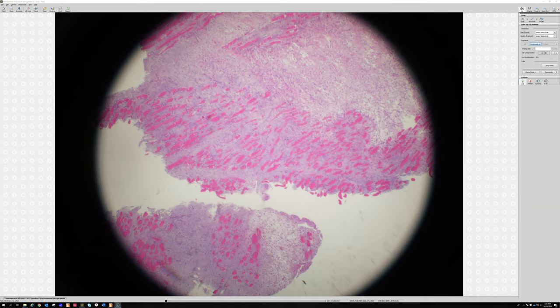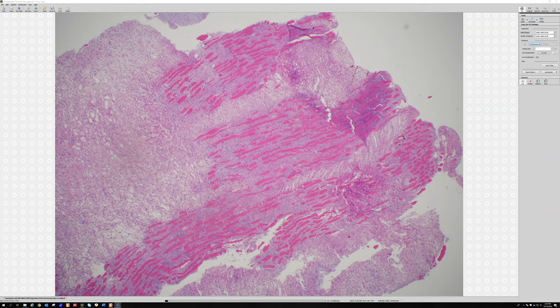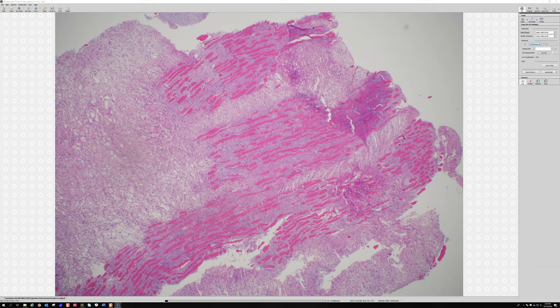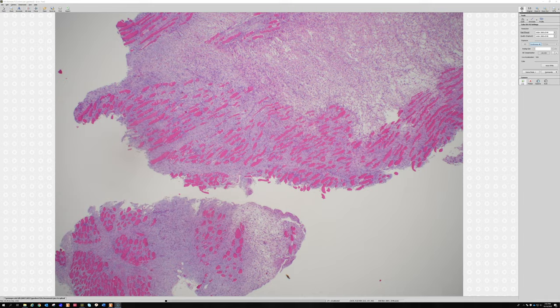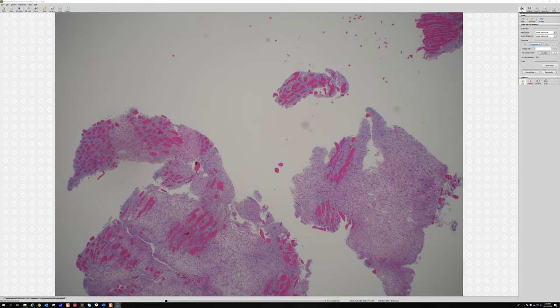But this low-power pattern is so key. Proliferative myositis in muscle splays apart each individual skeletal muscle fiber — and whole groups of fibers — which is an uncommon pattern for sarcomas. High-grade sarcomas usually grow rapidly and push everything out of the way, forming a big ball of tumor with smooth, non-infiltrated borders. A notable exception would be myxofibrosarcoma, which has a myxoid background and can infiltrate between muscle just like this does.